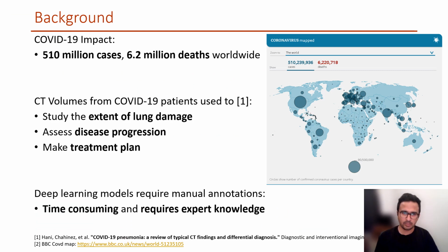As we are all aware, COVID-19 has had huge impact on millions of lives around the world. In clinics, CT volumes from COVID-19 patients have been used to study the extent of lung damage, assess disease progression, as well as make relevant treatment plans. This data is quite useful for training deep learning models. However, training such models requires manual annotation of the data, which is often time consuming and requires expert knowledge.